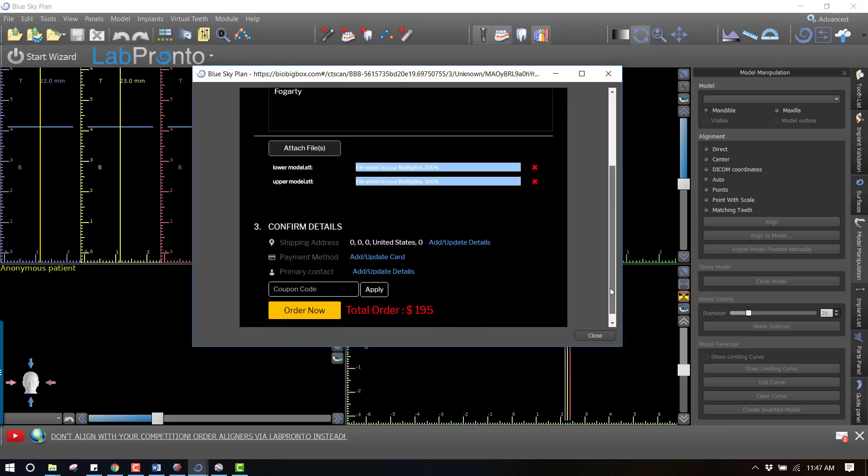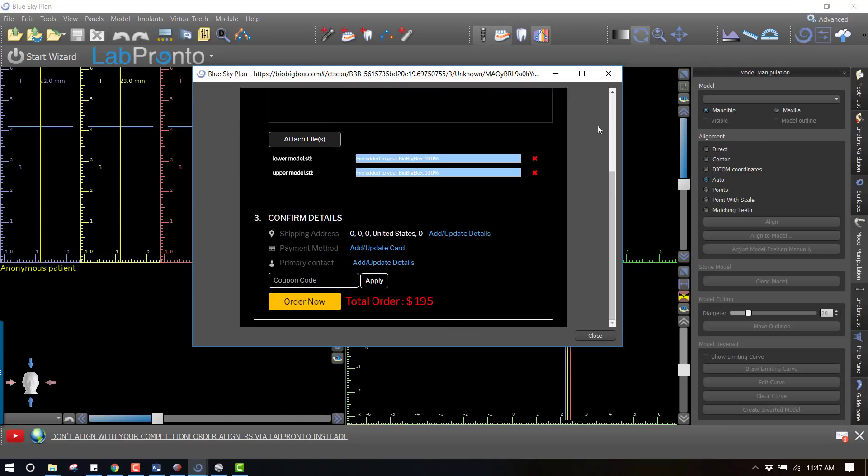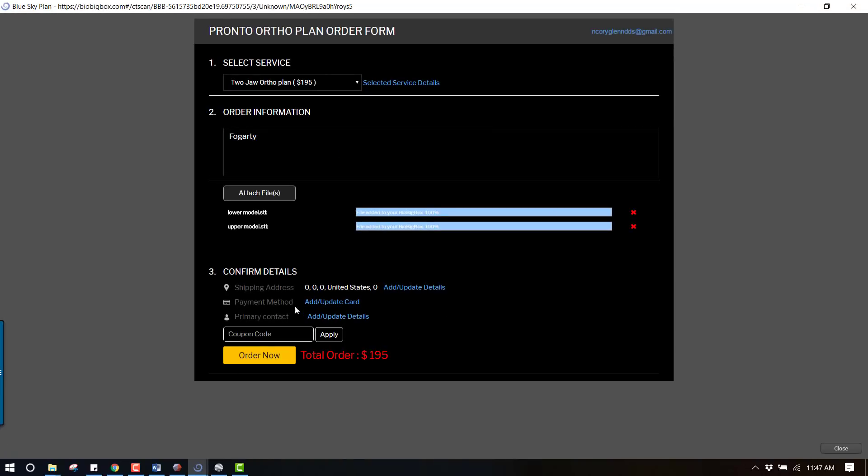So the files have finished uploading and you can scroll down and see the bottom of the form here. At this point we just simply put in our order information - we can say order now, you can update your card. I'm not going to do that right now because I don't want you to see my credit card and pay for your ortho too, but you would put in your information and simply say order now. I'll continue this video once I actually have the files back.